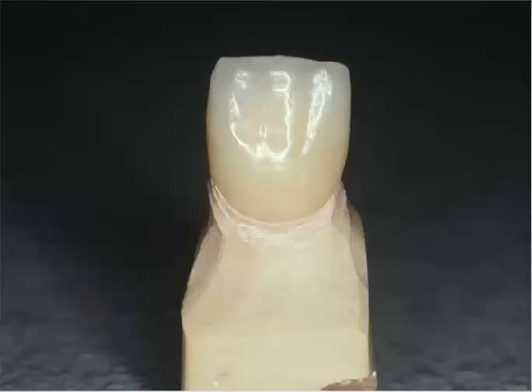The other thing which really ties into what we're talking about tonight is the absolute impeccable fit of these CAD/CAM or pressed ceramic crowns. We can get the marginal adaptation down within 75 microns or so, which to me is incredible. These are the best fitting restorations I've ever been able to place for a patient.